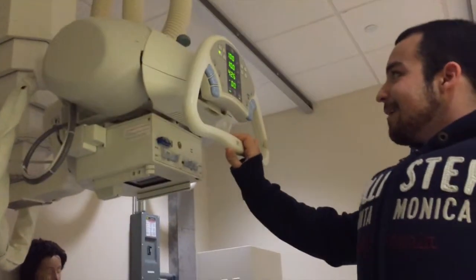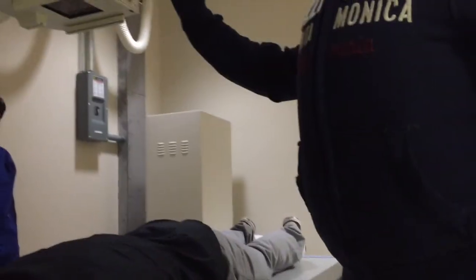Well, the first thing you're going to do is get an 8x10 IR. Go ahead and put it in the bucky, which has a grid. You want to use a grid for these kinds of x-rays. Next thing you want to do is make sure you've got a 40-inch SID. That means distance.